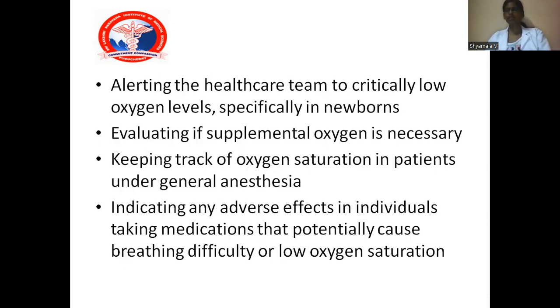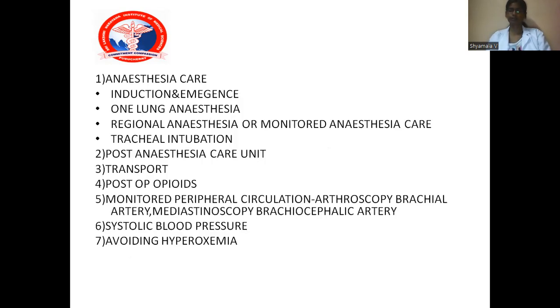It also helps in alerting the healthcare team to critically low oxygen levels, specifically in newborns, in evaluating if supplemental oxygen is necessary or not, and keeping track of oxygen saturation in patients under general anesthesia. It is also indicating any adverse event in individuals taking drugs that cause potentially breathing difficulty and low oxygen saturation, like opioids.